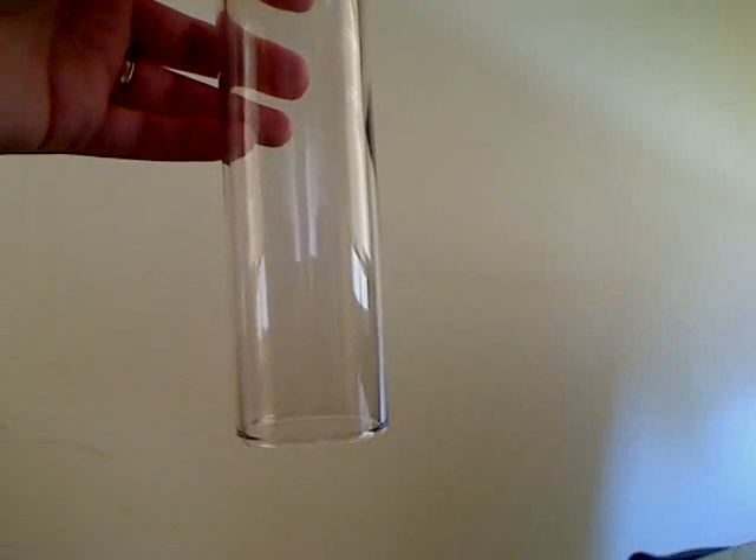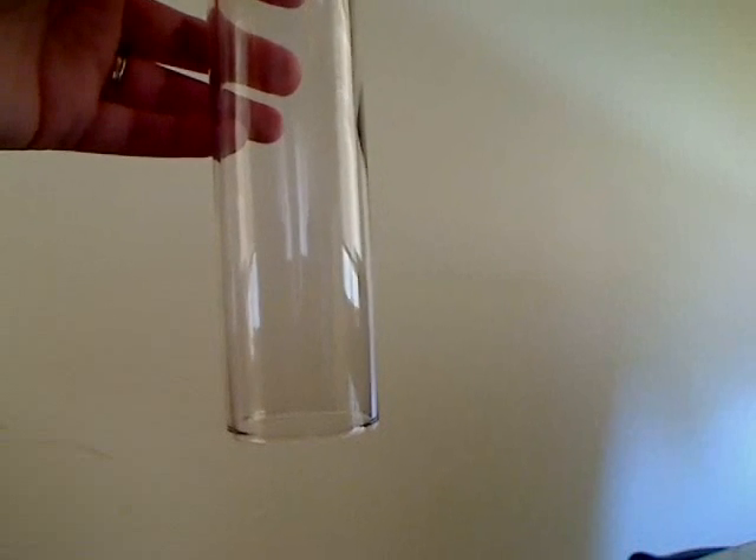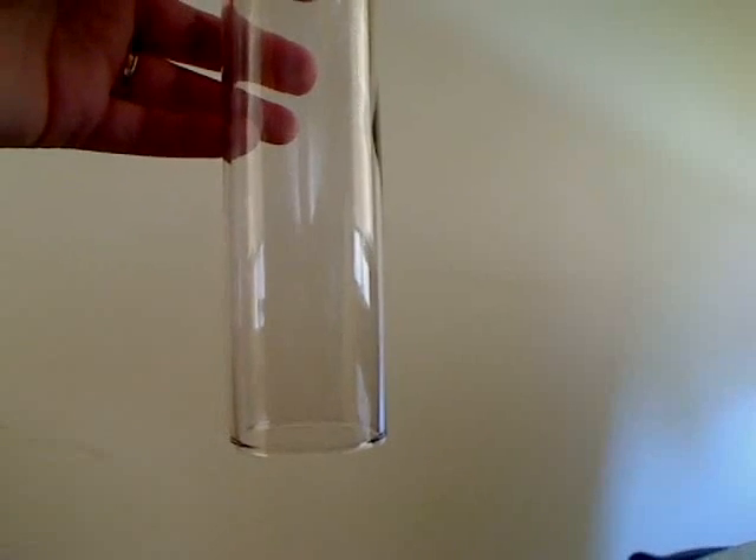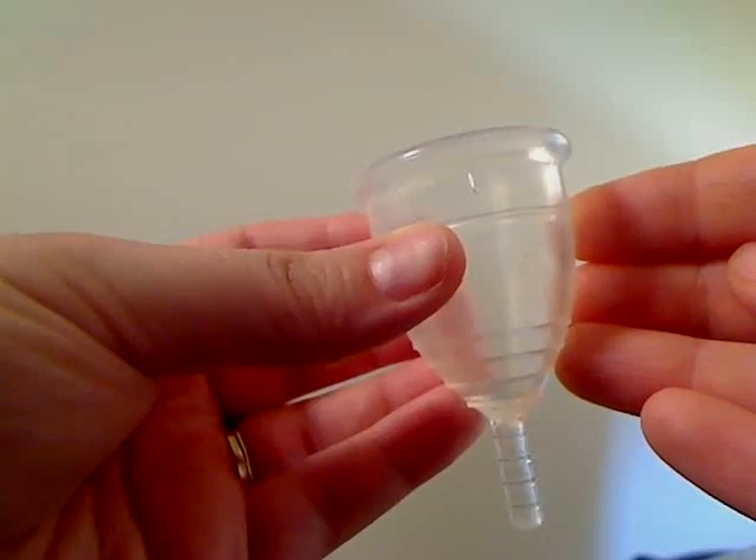Okay, now on to how to use it. We're going to be using this glass as a demonstration, and I know it's wider and longer than an actual vagina, but it was the only good example I could find. So to insert it, there's two folds.